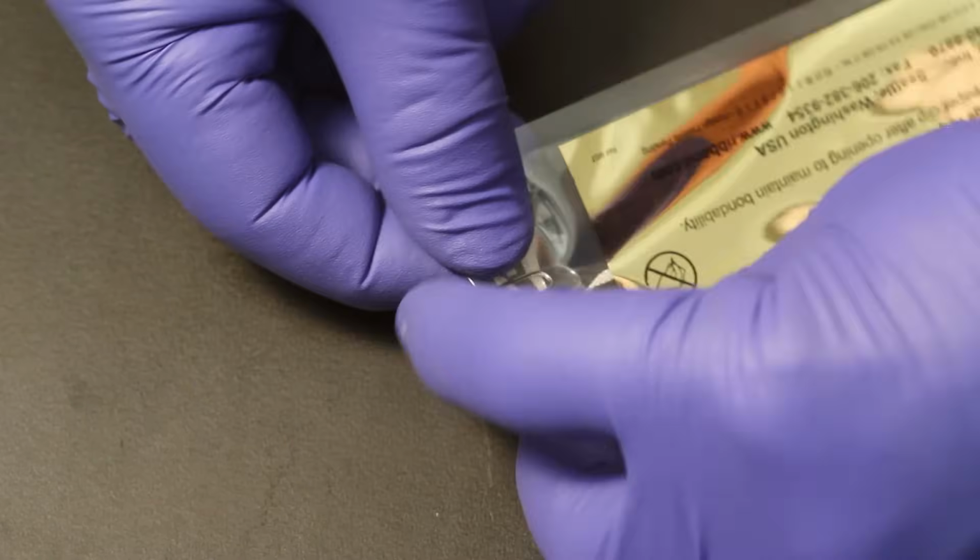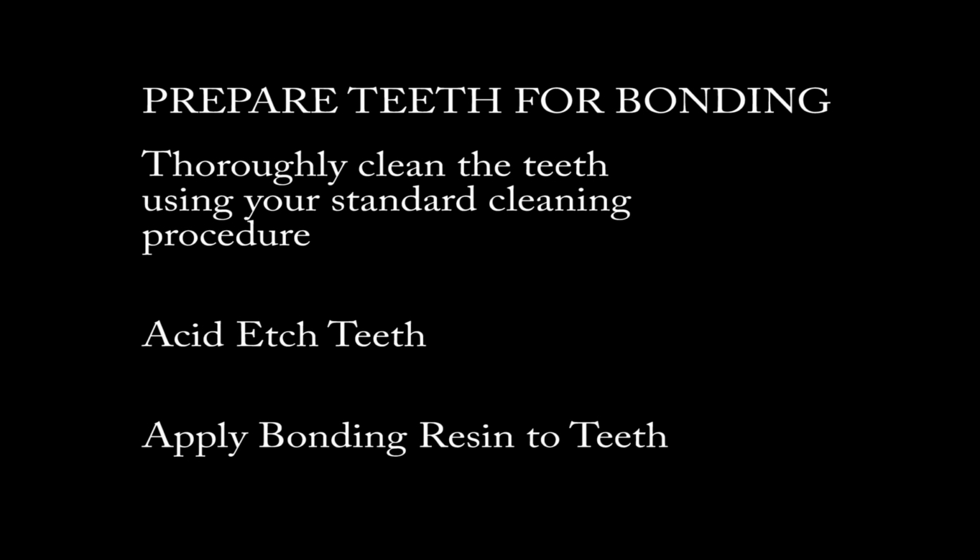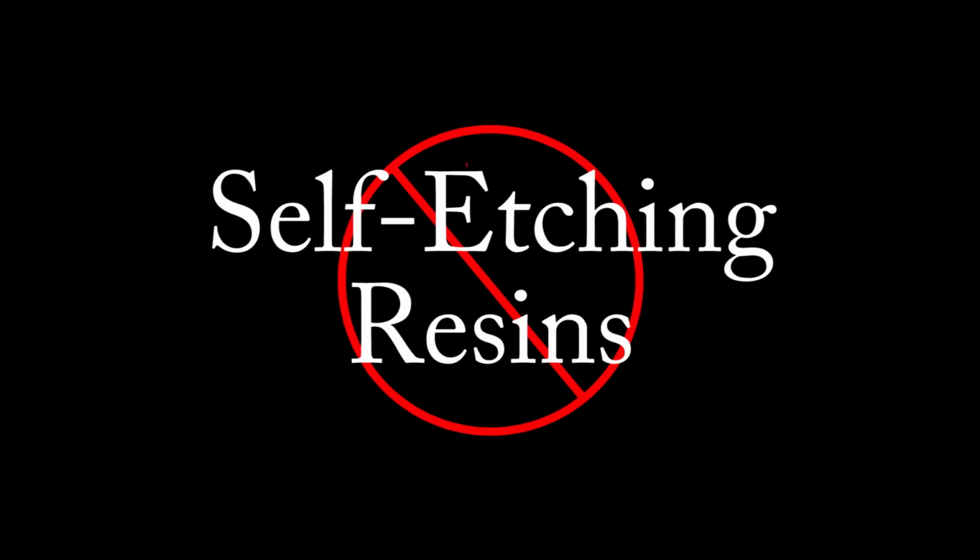Clean the teeth and prepare the teeth for bonding. Clean and acid etch the teeth and apply the bonding adhesive using your standard bonding technique and materials. Please note that since there is no clinical evidence supporting the use of self-etching resins for this type of retentive bonding, we do not recommend using self-etching resins for this procedure.